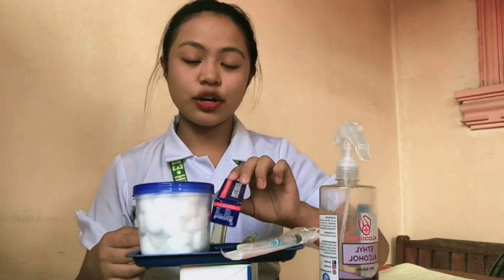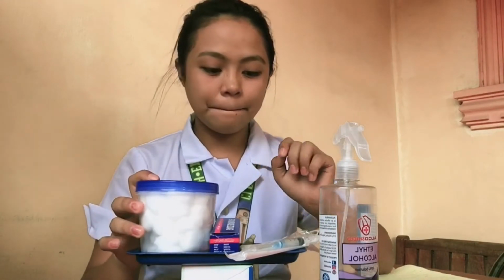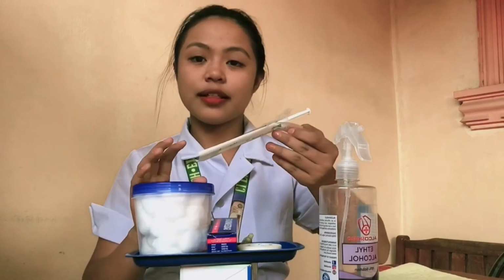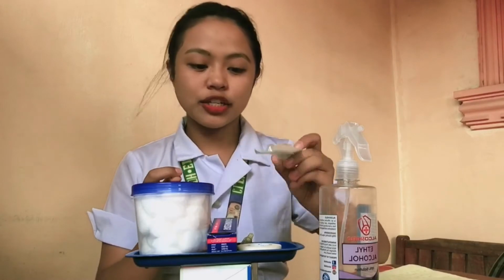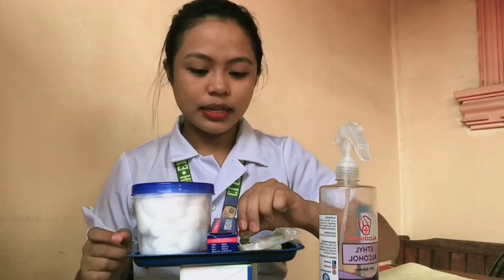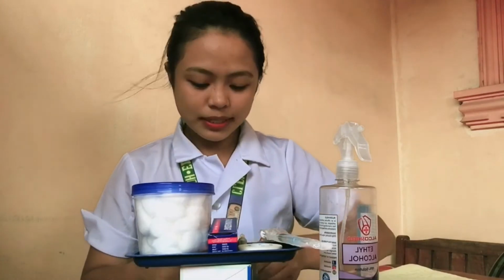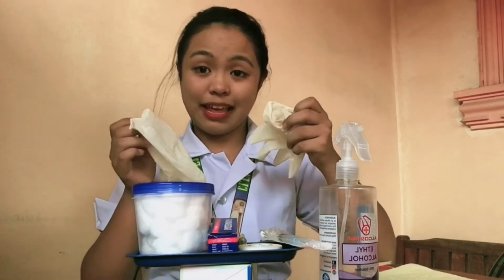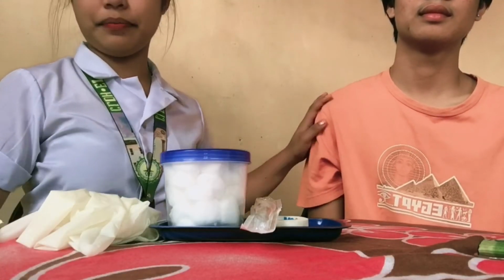First is the gauze or bandage if necessary, and the cotton balls with alcohol inside for us to perform the antiseptic technique, and our syringe that measures 3 cc or 3 ml, with 2 ml of medication that I prepared from our ampule. Next are the clean gloves that we have for us to be safe. For this procedure, I'm using the patient's arm.